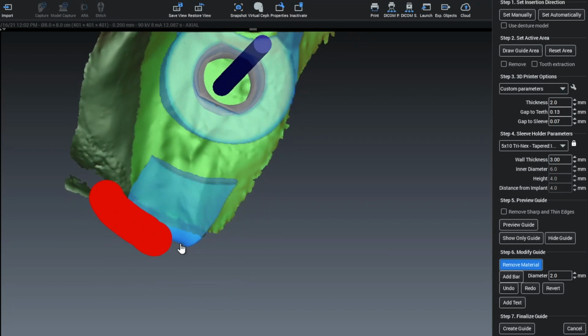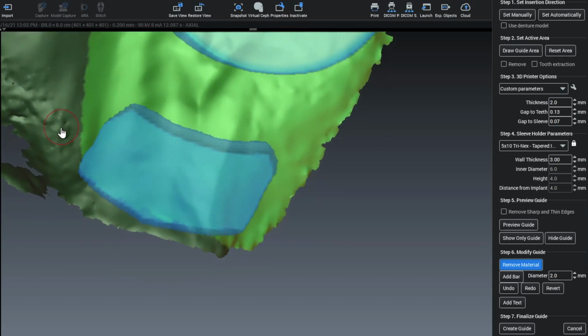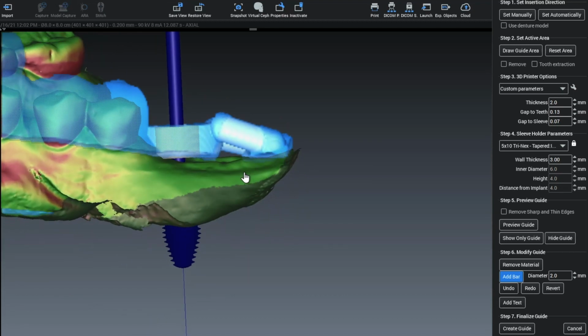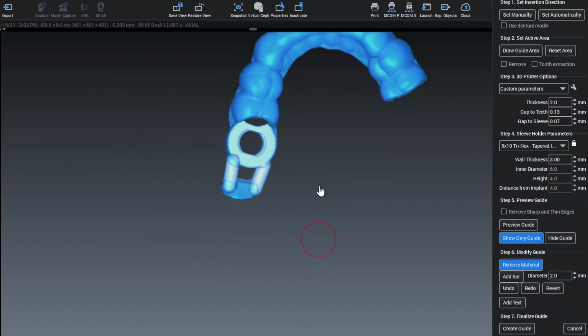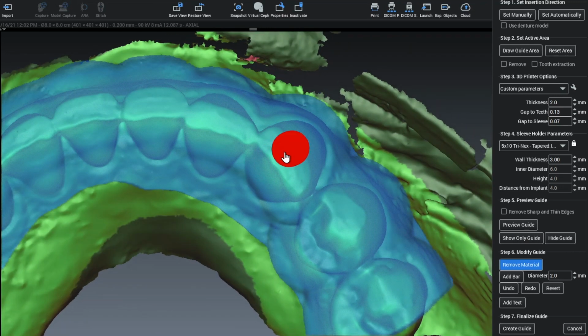So essentially all you do is select a little bit of an area posterior to your surgical guide, and you want a patch roughly a few millimeters square, if not more, and you want the space between the guide sleeve holder and that patch to have a little gap, so you can see how we've erased it to create that space. And what that will do is alleviate the risk of the guide coming unseated by giving you some posterior support. So we're just trimming the guide. I added bars to that patch to give it the support it needs. And here we are, just finalizing our guide design.